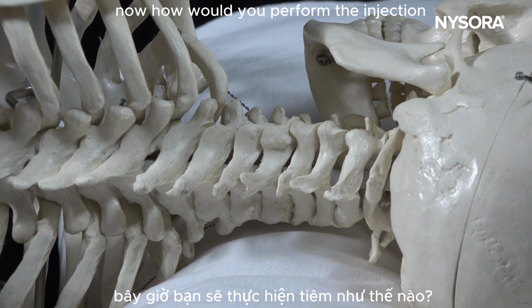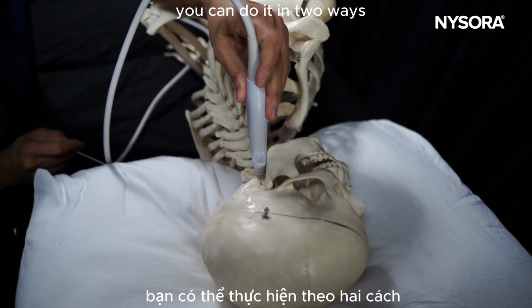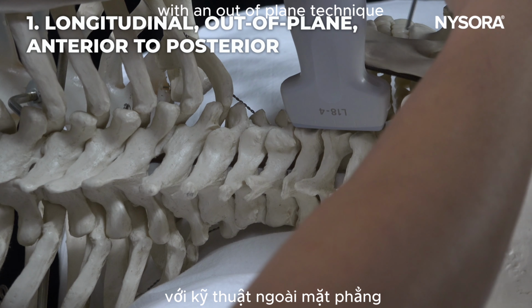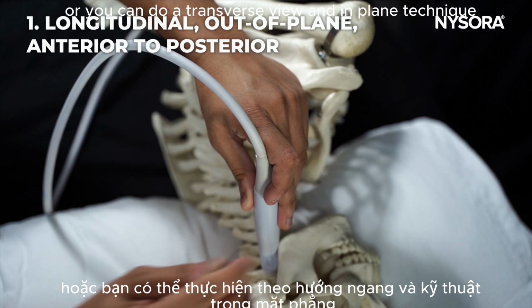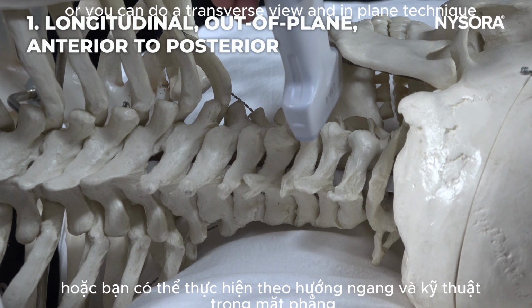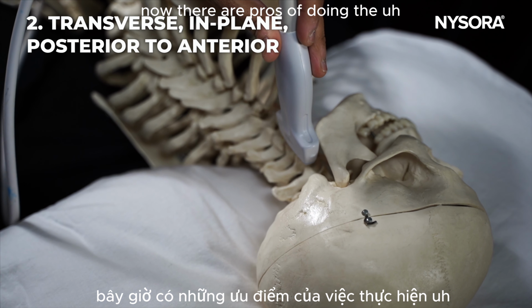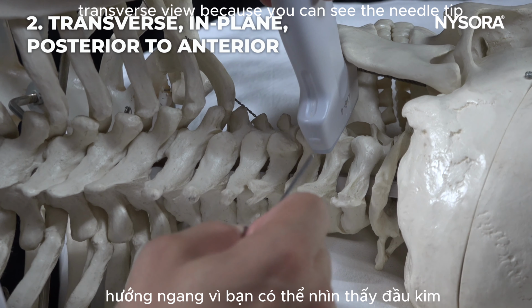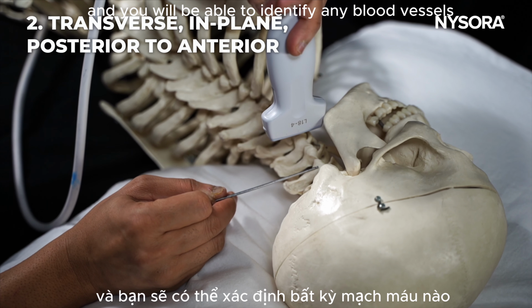Now, how would you perform the injection? You can do it in two ways. You can do it in the longitudinal view with an out-of-plane technique from anterior to posterior, or you can do a transverse view and in-plane technique. There are pros of doing the transverse view because you can see the needle tip and you will be able to identify any blood vessels.